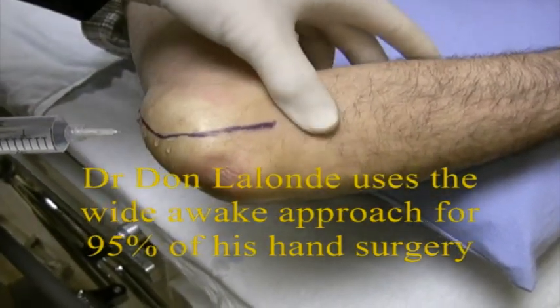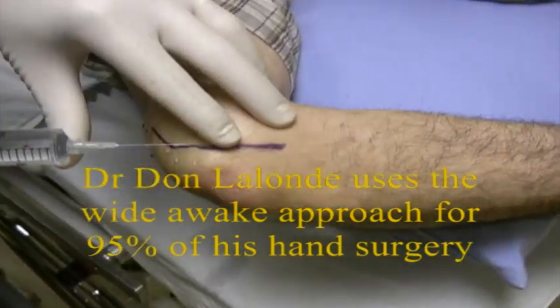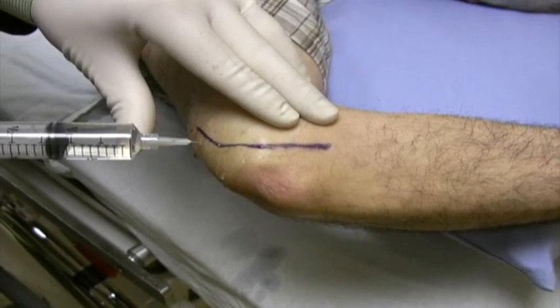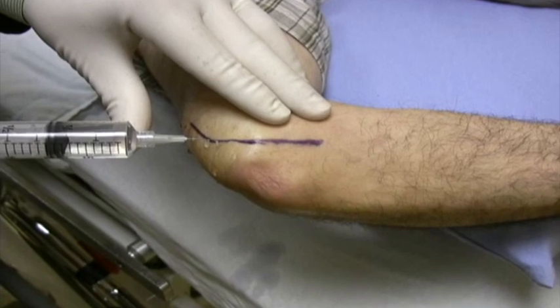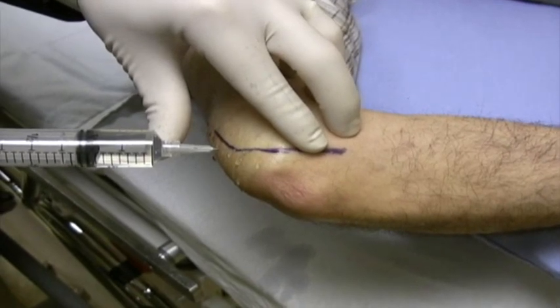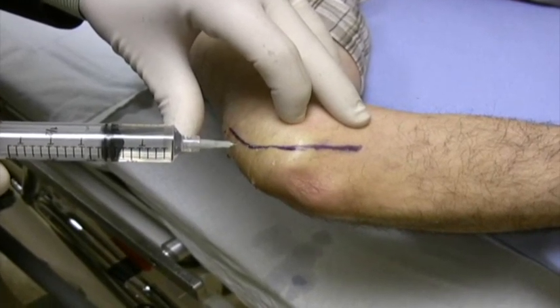Could you extend your arm just a little bit more? Beautiful. Just to loosen up that skin right over the cubital tunnel. Another important point here is to just give the local time to work. I've had over 30 digital blocks myself, and every time that I have one, it's amazing to me that the intensity of the anesthesia increases over half an hour after you put the anesthetic in.